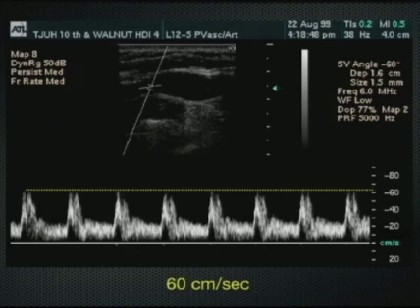This then allows us to calculate the angle between the presumed direction of flow and the direction of the ultrasound pulse. And in this example, as illustrated in the annotations provided on the right of the image, the angle is 60 degrees.